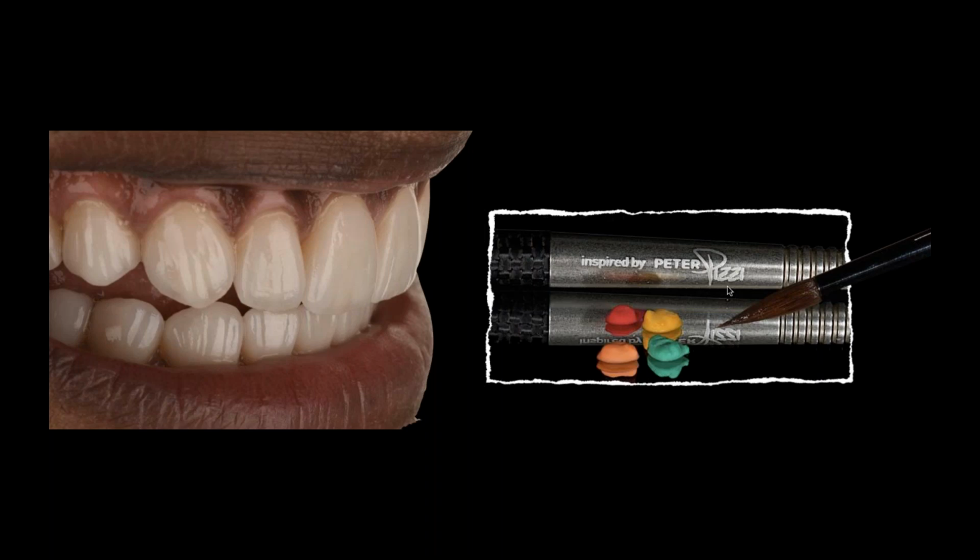So think about what you could do with a mamelon. I could build up my canvas wall of ceramics, and I can actually paint mamelons on in microns, right? Not even a full 1/10 of a millimeter, and still get effect out of it. I couldn't do that with every opacious dentin because I would need more thickness. So you get more opacity and more fluorescence in the mamelon materials, definitely.